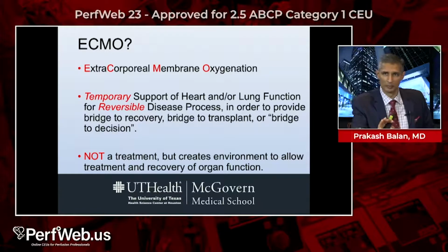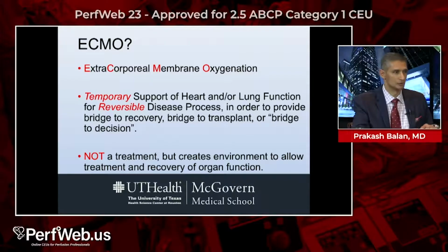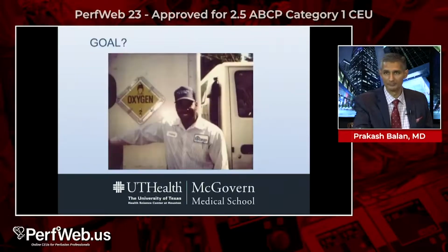What is the purpose of ECMO? It's temporary support for heart and/or lung function for a reversible disease process in order to bridge the patient to something better. It is not a treatment in and of itself, but it creates an environment to allow us to treat the underlying problem.